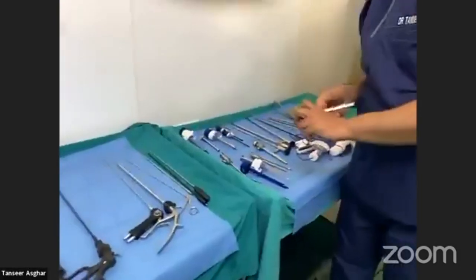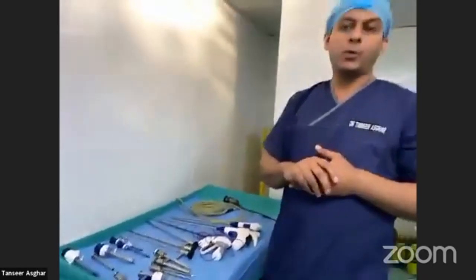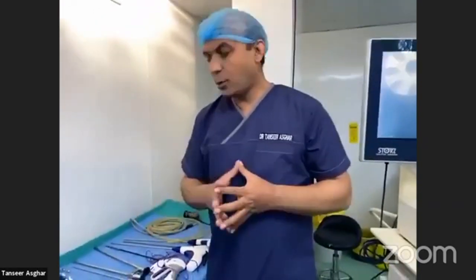This was a brief description about the ports. The most commonly used instruments in basic laparoscopy are 10 or 11 mm ports and 5 mm ports in general surgery and most gynecological surgeries. The smaller trocars used in pediatric surgery patients are also available.